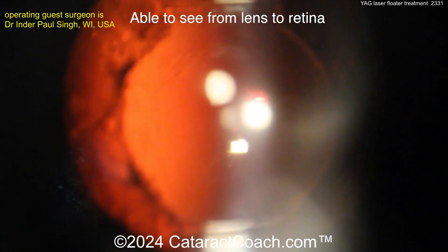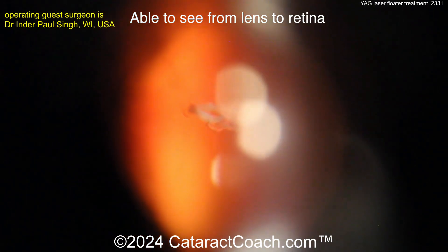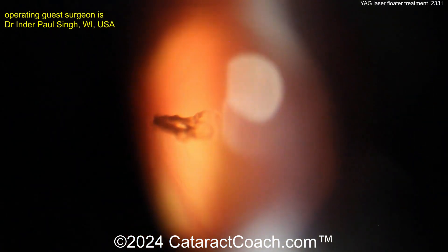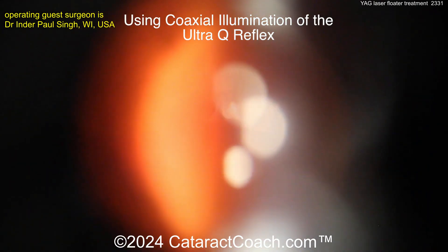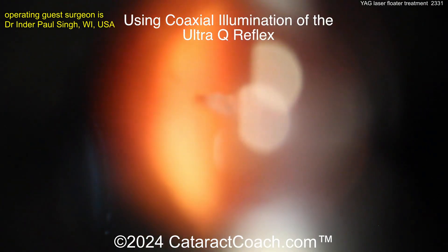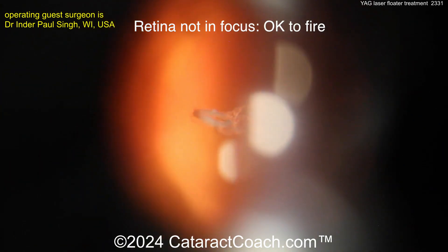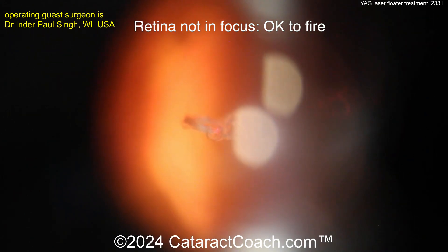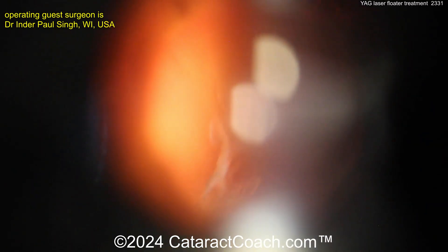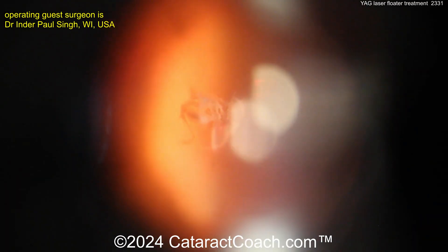This is a YAG vitreolysis case using the LX Ultra Q Reflex laser, specifically designed for vitreolysis. Here we are visualizing a large Weiss ring in the middle of the vitreous. Using the coaxial illumination of the laser, we are able to visualize from the lens all the way to the retina to give ourselves spatial context. We see the large Weiss ring in the middle of the vitreous, and the retina not being in focus, thus allowing us to feel comfortable firing the laser. Coaxial illumination is key because it gives us the spatial context we need.